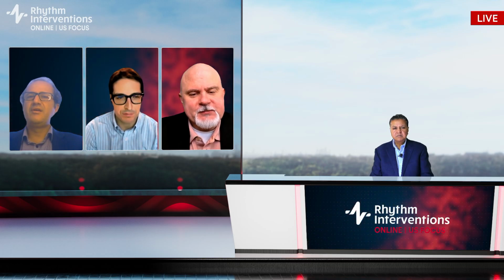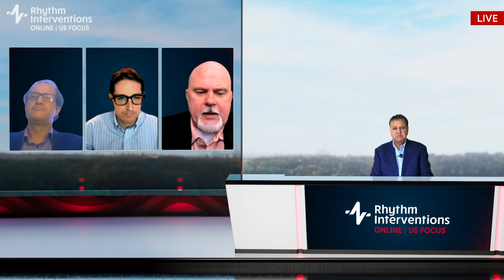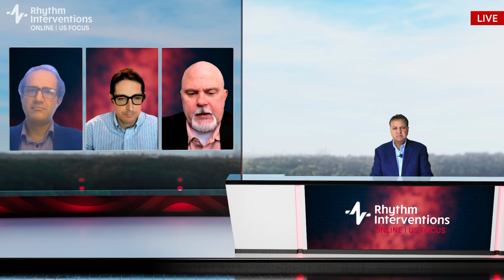Now, the other question was about atrial flutters. If you go for ablation, now, RF or PFA? Our group is kind of split on this, and I see both arguments for it. I have come down on the side of, okay, if I have an atypical flutter and I have access to a PFA catheter with a large footprint, I don't have to be that precise.